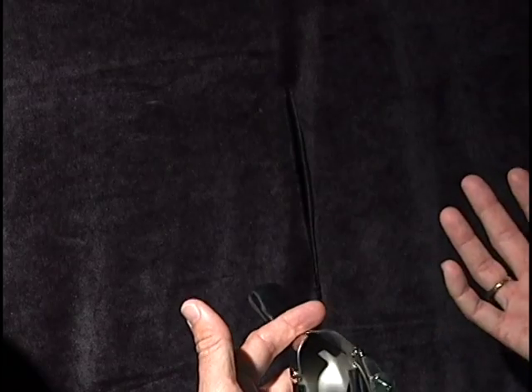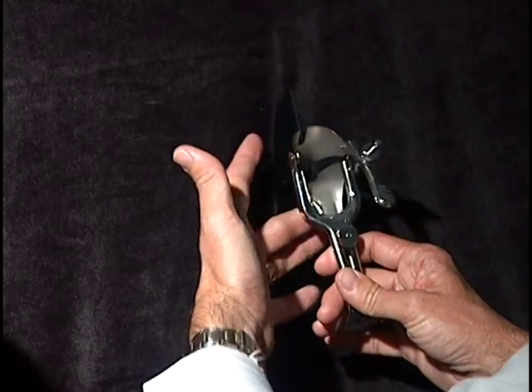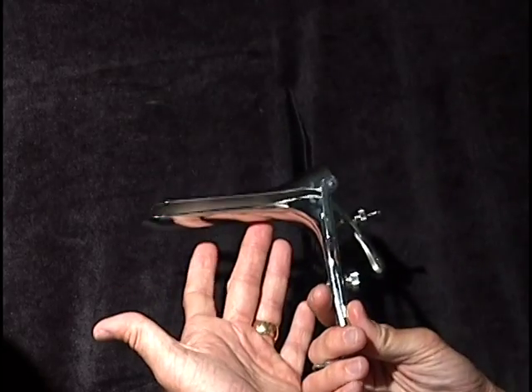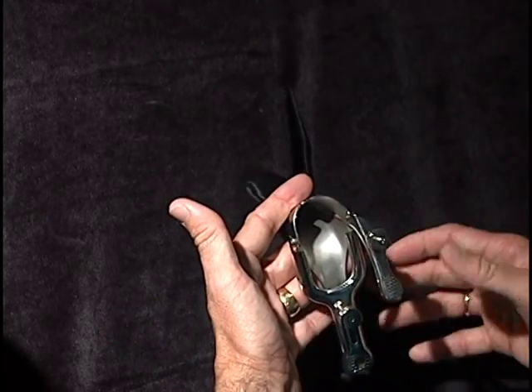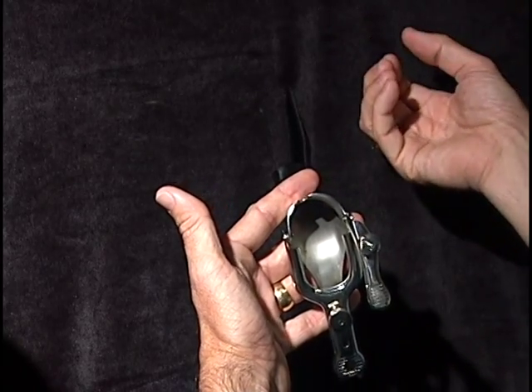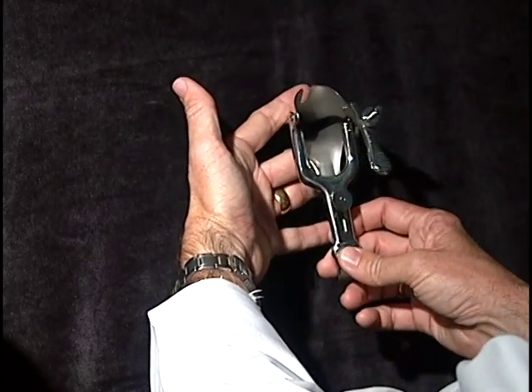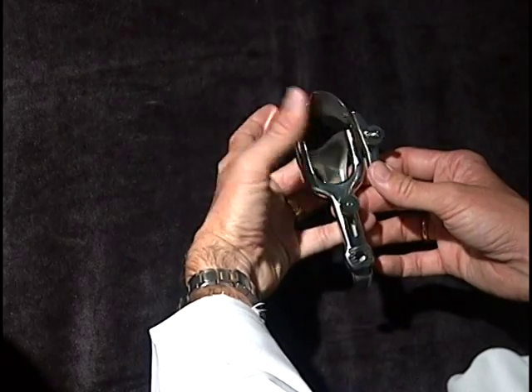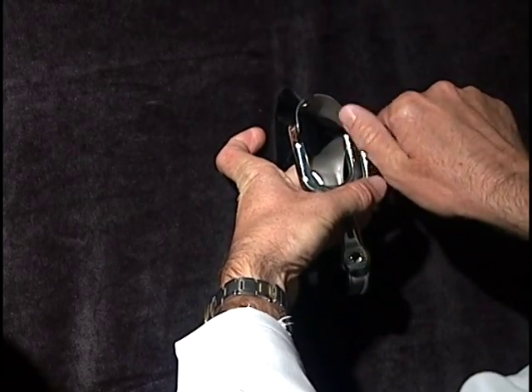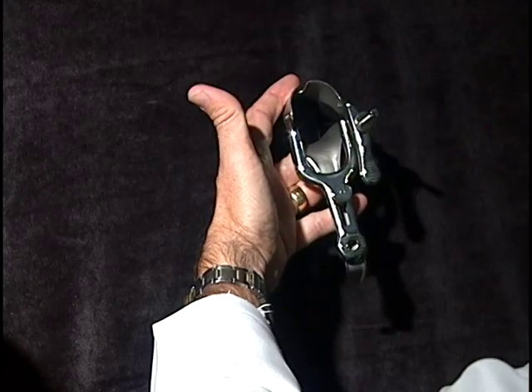The first demonstration is for the first trimester abortion, done anywhere between five weeks and 12 weeks. This is a speculum — it's what allows us to see the cervix, which is the lowest part of the womb. The speculum would be placed on the inside, opened up by the abortionist, and used to look at the cervix.